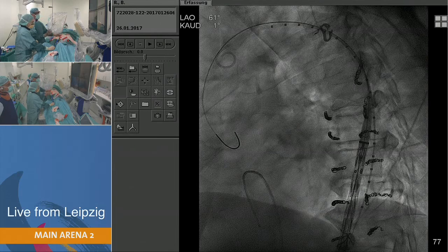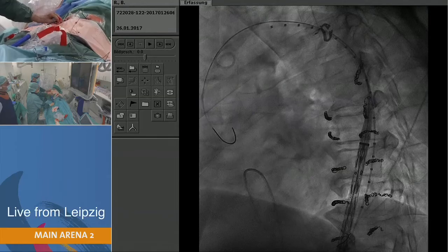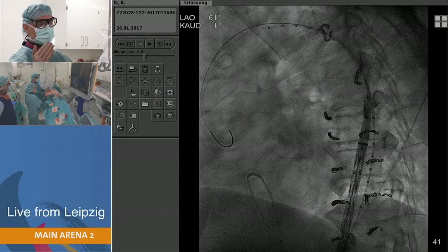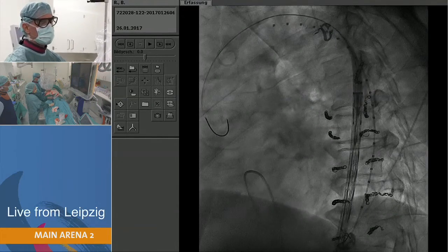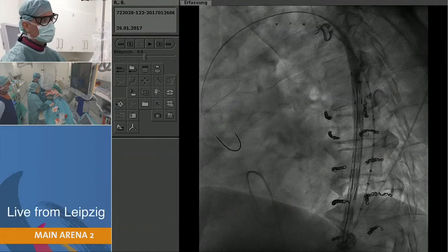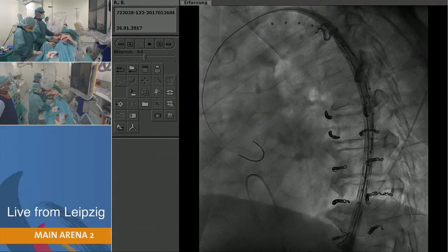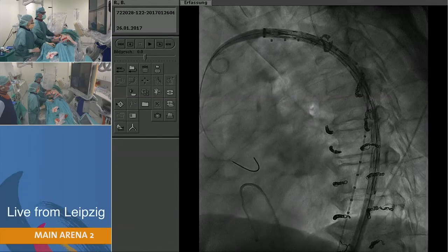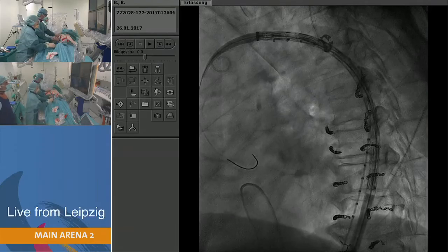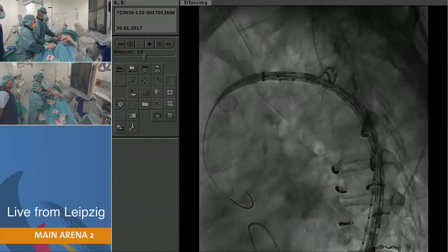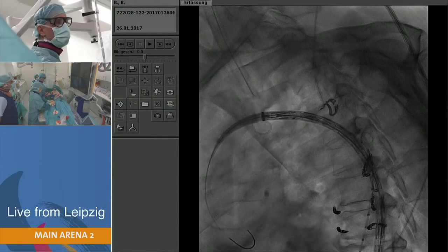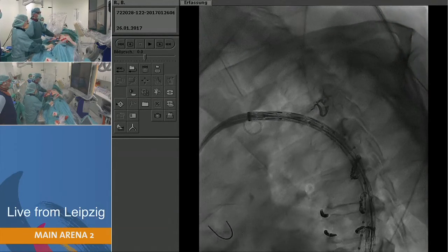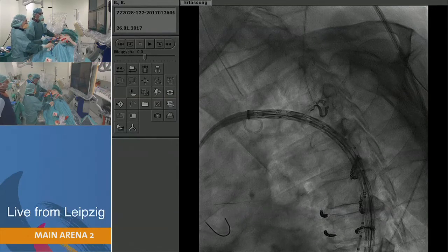At the tip of the graft there are two markers: an H-shape on the right side and an O on the left side. There is a stabilization strut on the outer curvature, so the H should be on the outside and at deployment should appear not as an H but as a straight line along the outer curvature. We are using a left oblique angulation of 60–61 degrees, which is appropriate here.